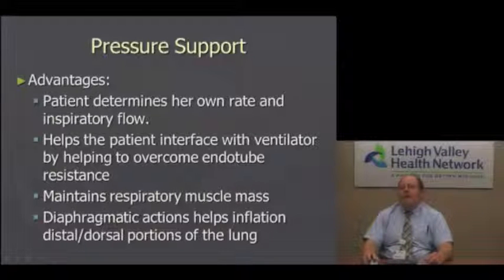And one of the reasons we always attempt to have the patient breathe spontaneously when we can is because of this statement right here. No matter how expensive our ventilators are, no matter how much technology we have on them, the ventilator is not as efficient as spontaneous breathing. The act of breathing causes the diaphragm to act as a piston. It will cause the dorsal dependent lungs to be inflated just by the action of the diaphragm moving up and down.